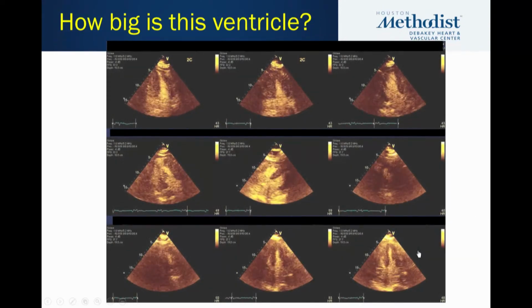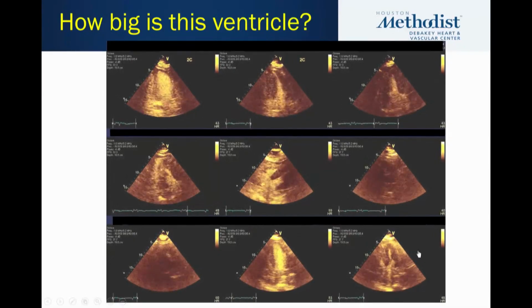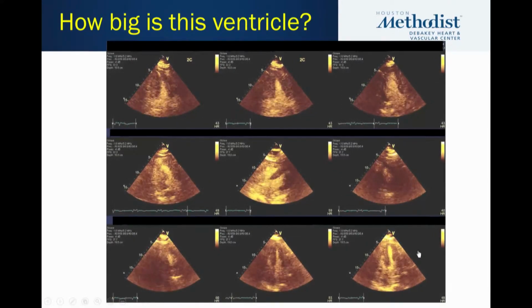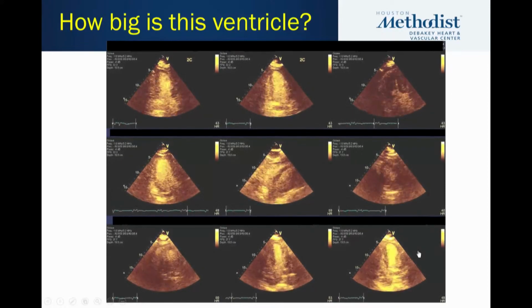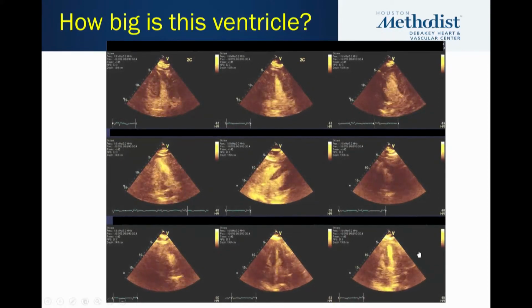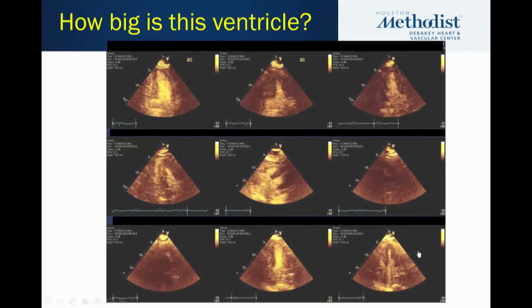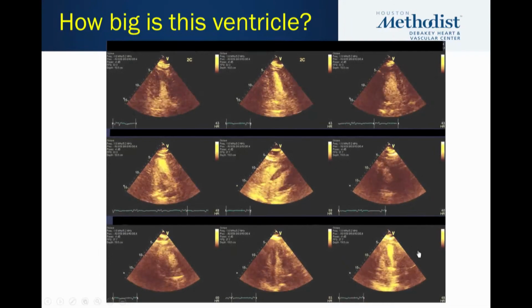However, in this patient, contrast was given. And in some patients like this one, when one gives contrast, it's like turning the lights on. You see now beautiful pictures of the left ventricle in multiple views, allowing us to estimate or subjectively evaluate. It looks like a hyperdynamic heart, but also make measurements.